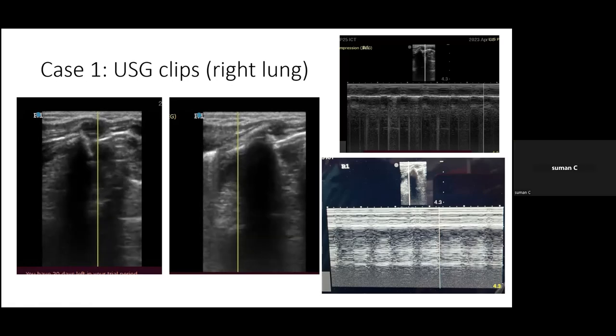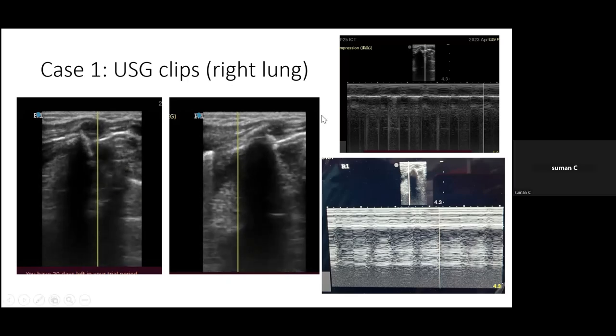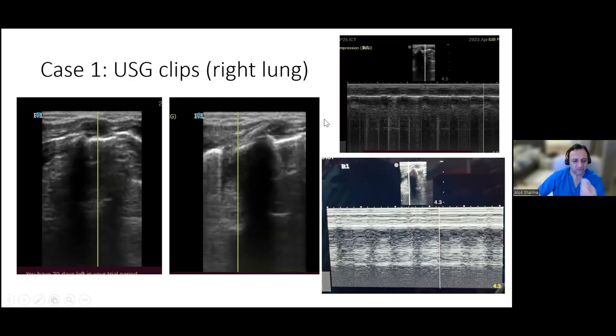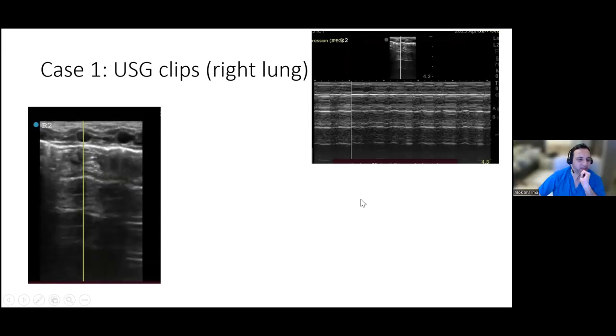Actually, to tell you the background, initially I did not get this pneumothorax, but I had this strong suspicion. So I did it again, and finally I could find that. The previous image that I showed you in the previous slide was the first image. This one I got. Yep. So I got a few more images, but I haven't shown you here. There are quite a few of them in the series. Okay. Do you have them? I have, but I haven't shown it here. Yeah, because here, this is very nice.